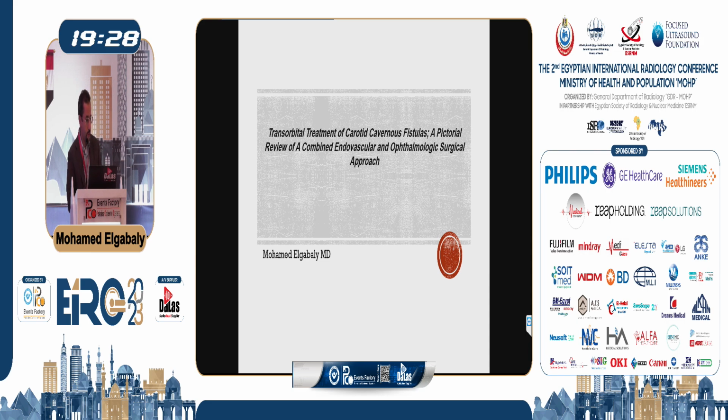Got a few pictures on the transorbital route for treatment of carotid cavernous fistulas, and how we can utilize the ophthalmic veins to get access to the fistulous pouch.